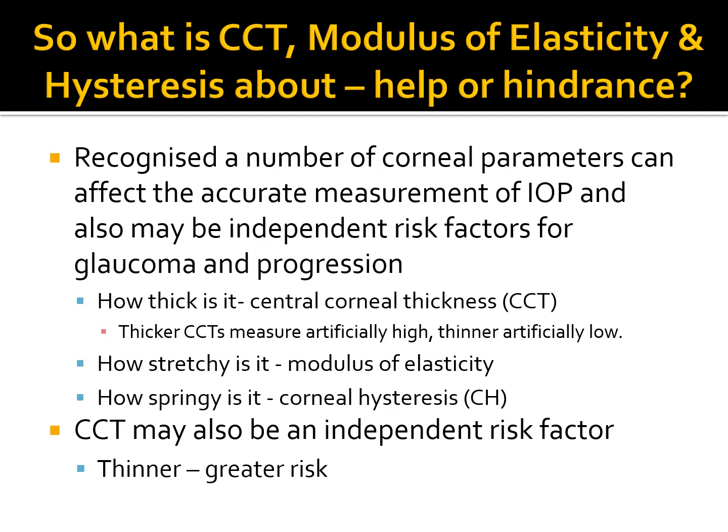So how thick is it? Central corneal thickness, CCT. Thicker corneas measure artificially high, thinner artificially low. How stretchy is it? They're saying that's the modulus of elasticity. And how springy is it? That's corneal hysteresis. Now, I'll come back to those things in a minute. They also say CCT may be an independent risk factor.